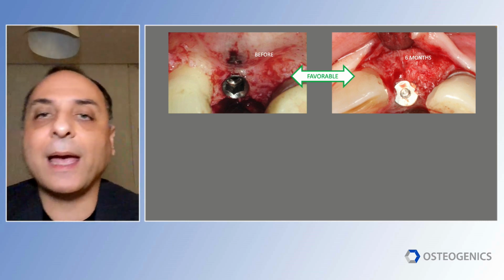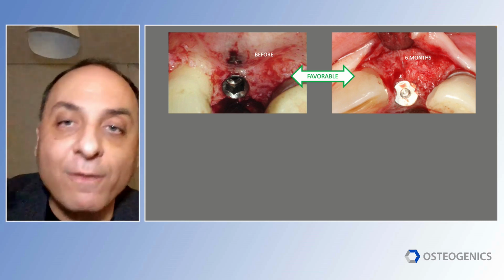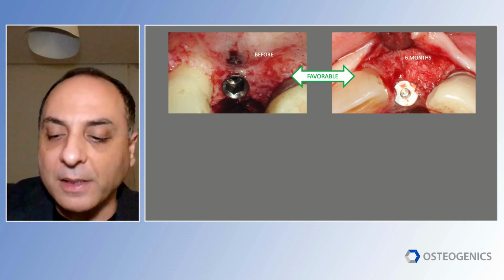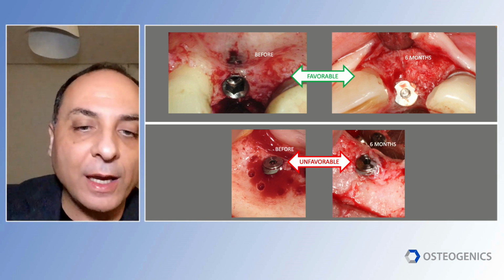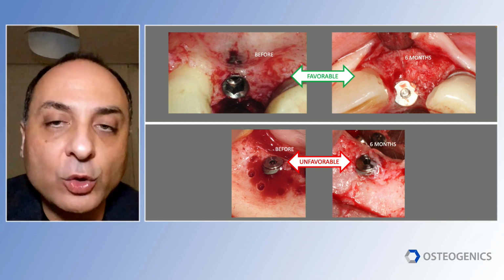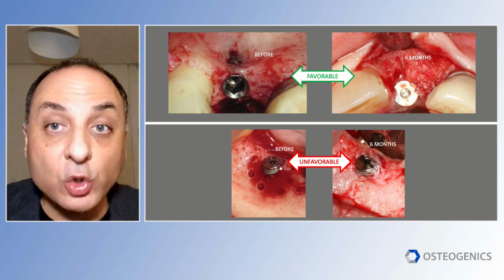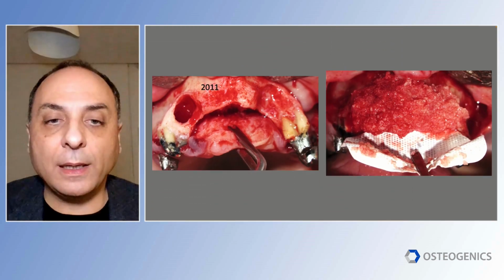So especially in the ridge, with allografts, I had a lot of variability in outcomes. Sometimes I had good, nice volume, sometimes average, sometimes small, and it was not stable and consistent. And I'm showing you here another case where the result was very little, probably 80 to 90% of the graft that I put in a ridge augmentation environment here, not socket, not sinus, has resorbed. It just disappeared.